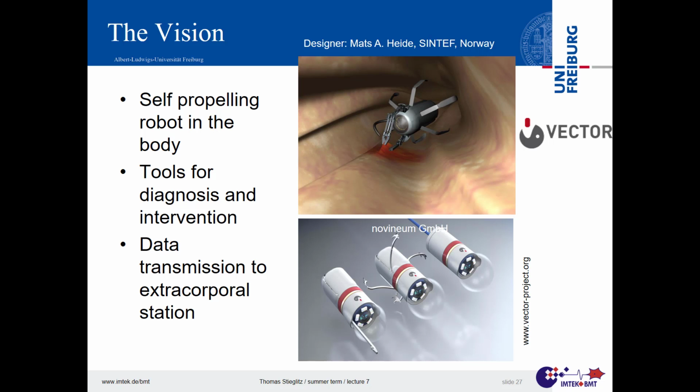And the top one of the wish list was a biopsy needle. Can't we have a biopsy needle that comes out, punches a bit of tissue out there that we can analyze later on? And that would mean you should have the biopsy needle hidden somewhere in the capsule. If you are at the right spot, like an old Mars expedition crawler, something comes out, takes the probe, puts the probe in again, closes the lid and travels on.